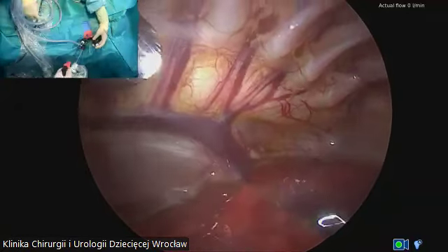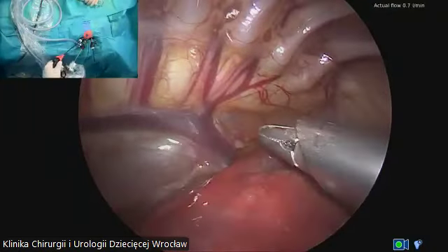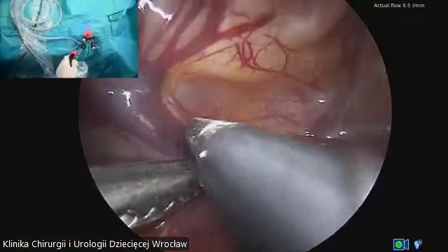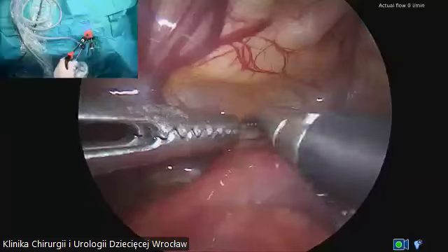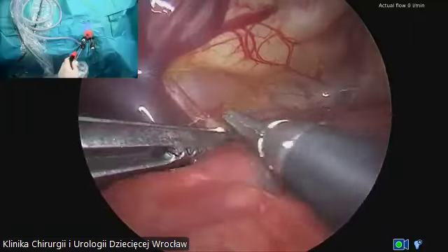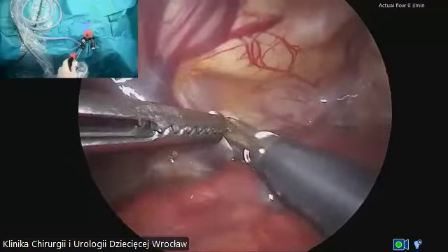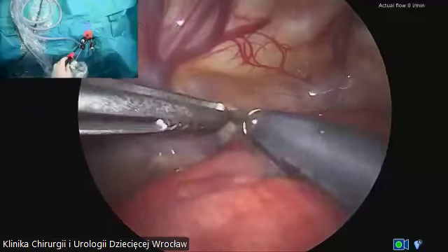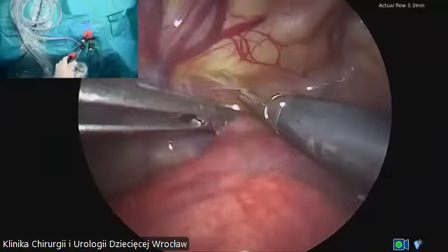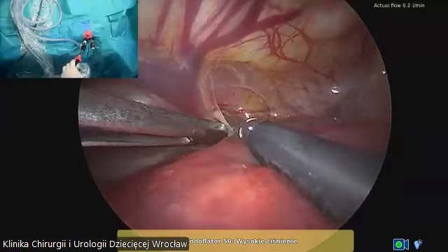This is what we like to do, to put some lubrication on the instruments to have a free movement. So because we know already from the bronchoscopy that the fistula is on the posterior wall of the chest, it's usually in such a situation that we start with the dissection above the azygos. That for us it's a landmark.